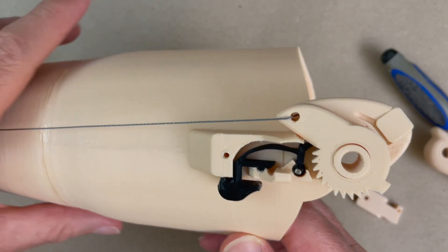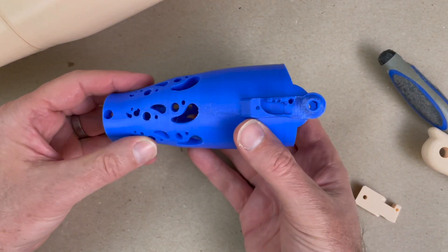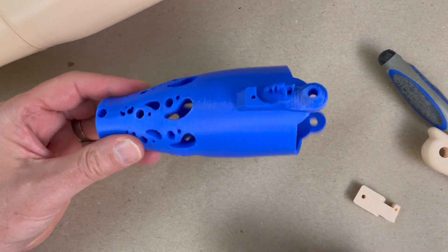I'm assembling this adult-size arm — it's easier to see the parts on the video. Here's a child-size arm. Everything is pretty much the same; it's going to function the same and go together the same, just on a smaller size. All right, let's get started.